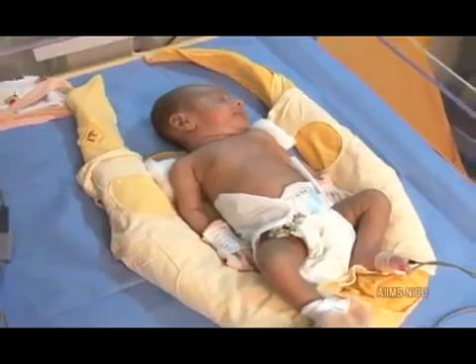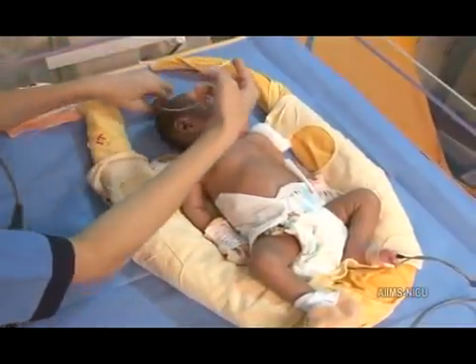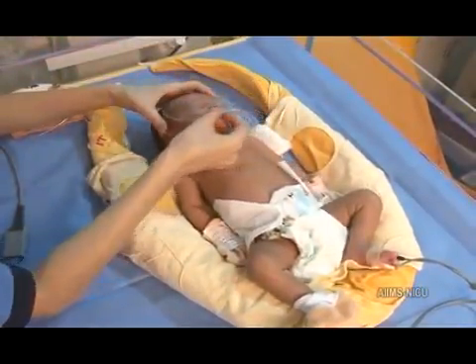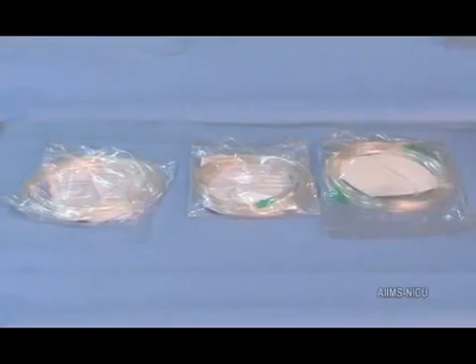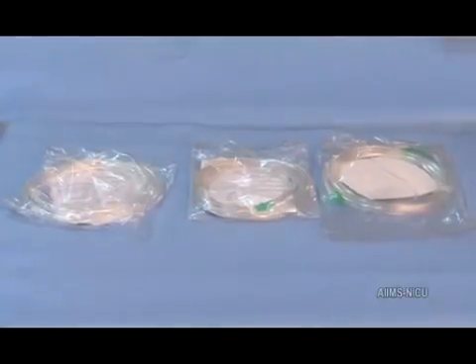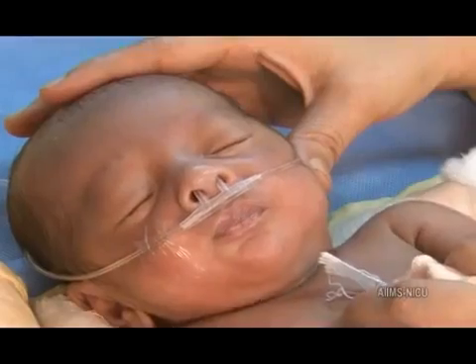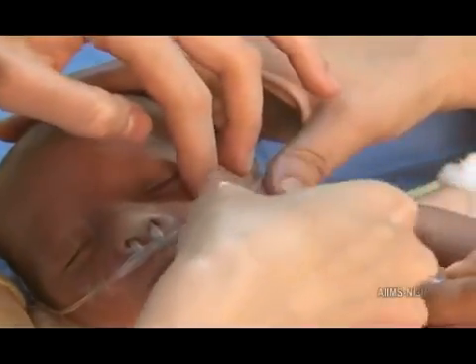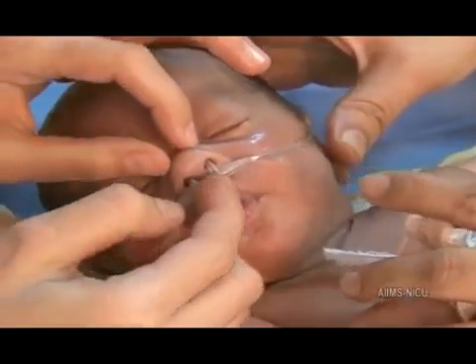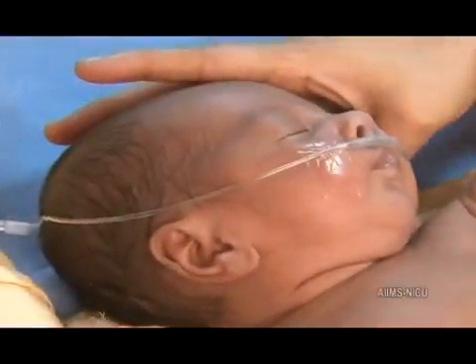Position the baby in the same way as explained earlier. Use appropriate size nasal prongs depending upon the weight of the baby. These prongs are available in 3 different sizes, separate for the neonate, for a pediatric patient and an adult. Secure the nasal cannula properly to avoid accidental displacement. Assess the improvement in color and the signs of respiratory distress after starting oxygen therapy.